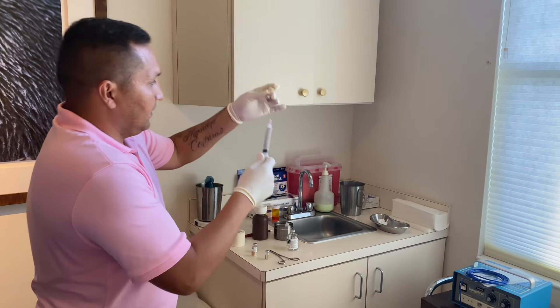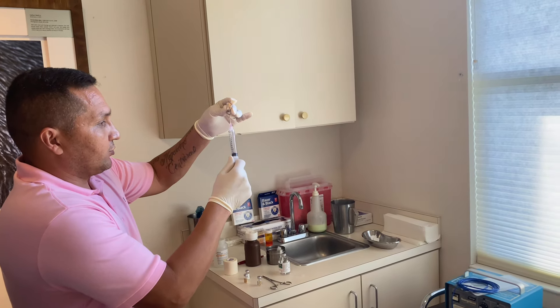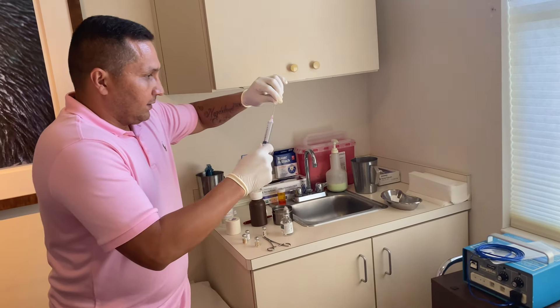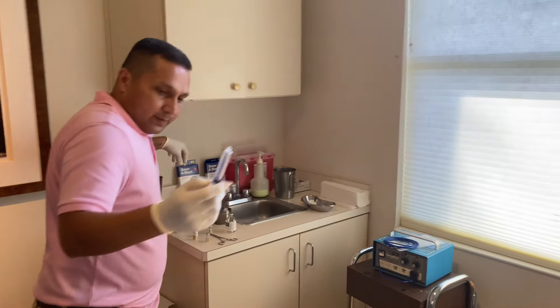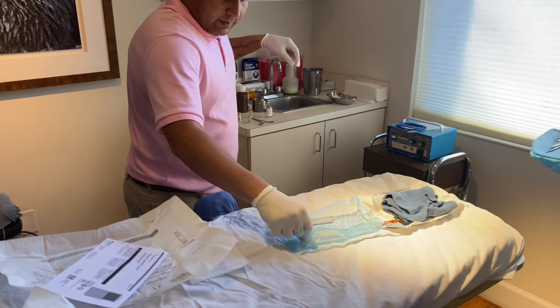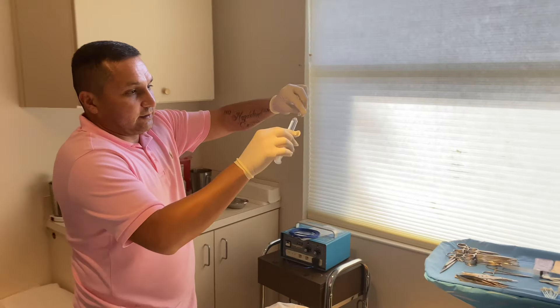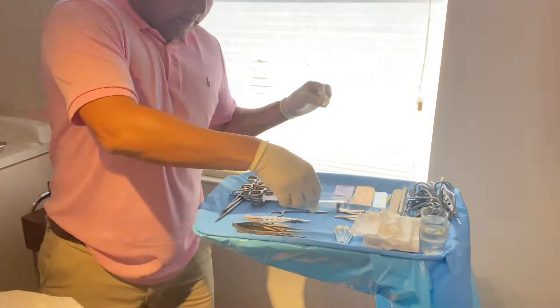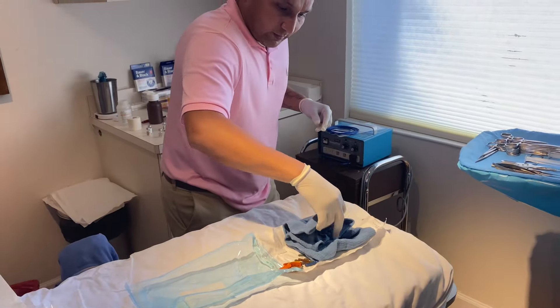Every once in a while, Dr. Stein will require an extra amount of supplement and will ring the bell for you to come in. My right hand is still sterile — it hasn't been contaminated. Then I'll switch the syringe over to my contaminated hand and put in the 27 gauge needle, slide it in there. My sterile right hand remains dominant throughout.